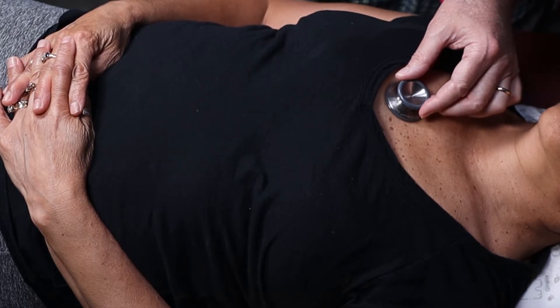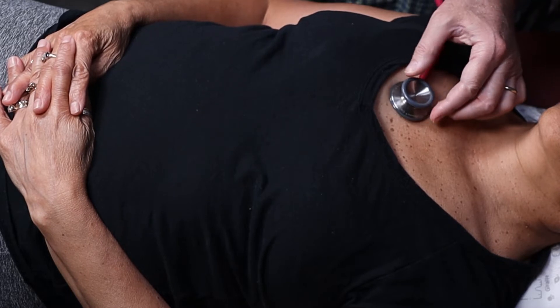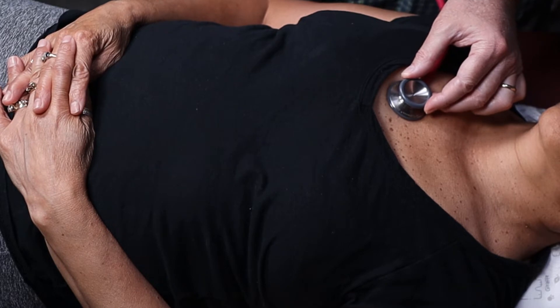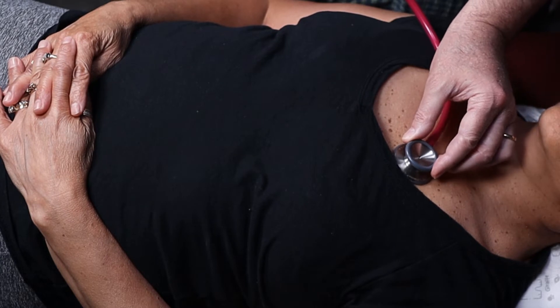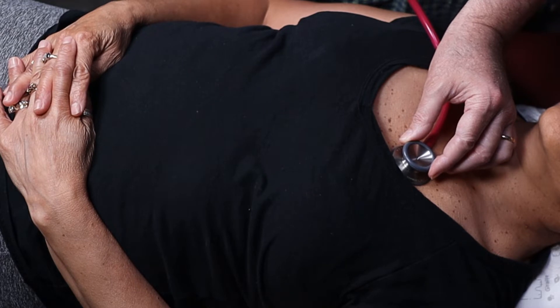For our lab, we're going to use a hopping technique. If I'm a student and I'm asked to do the general cardiac exam, this is what I'm going to do. I'm going to start here in the aortic area and listen for three long seconds — listening to the rate, the rhythm, and for murmurs. After three seconds, I'm going to hop over to the pulmonic area, which is the second intercostal space, left parasternal border. Listen for three seconds.